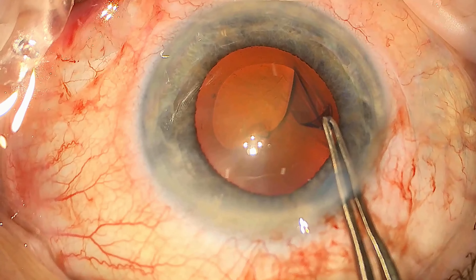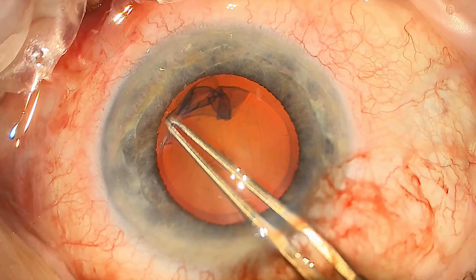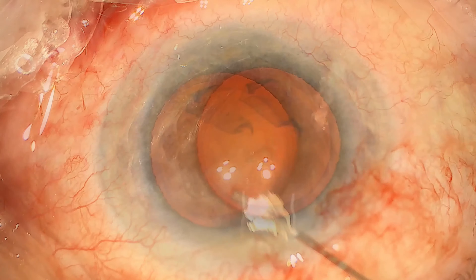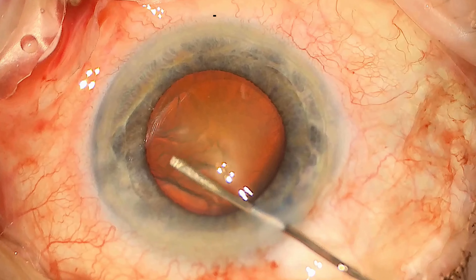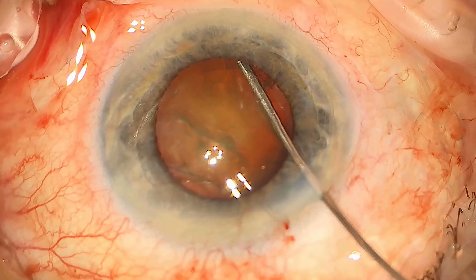The rest of the capsule needs to be maintained as it's used later on to insert the intraocular lens implant. Now performing hydrodissection — this loosens up the lens by propagating fluid around the cataract, allowing it to be manipulated and rotated, which can aid removal.